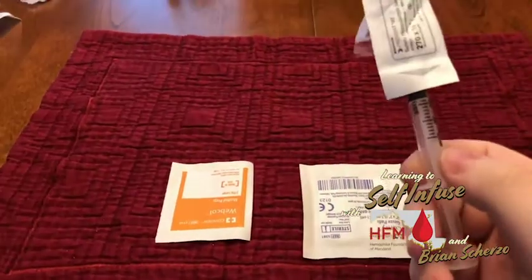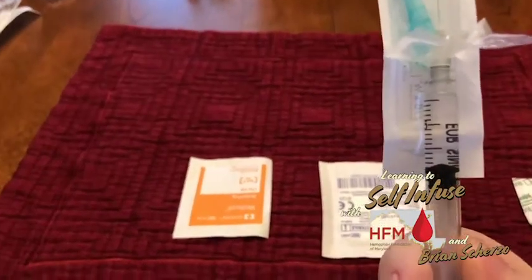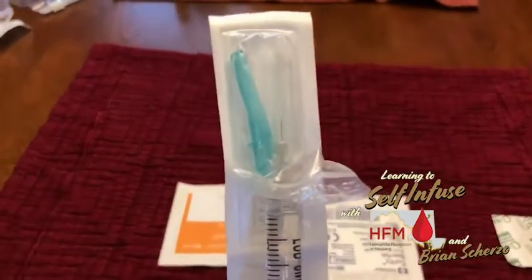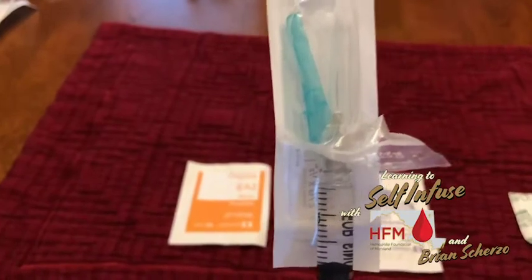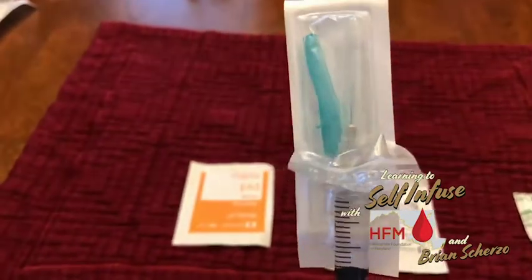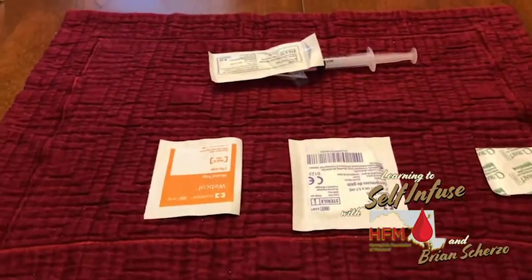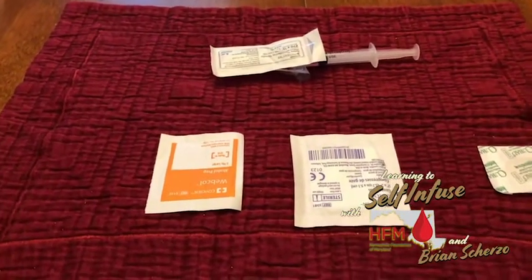After you draw up your prescribed amount, I've switched my draw needle out for my injector needle — it's a tiny little 27 gauge needle, fairly painless. Now I have all my other stuff that I need to actually do my injection laid out before me.